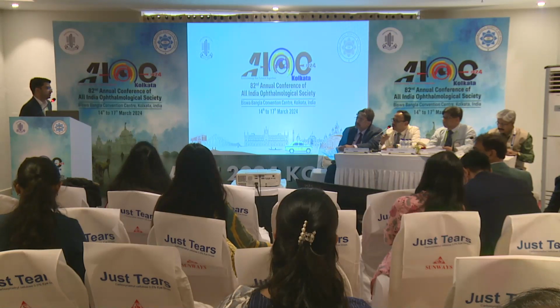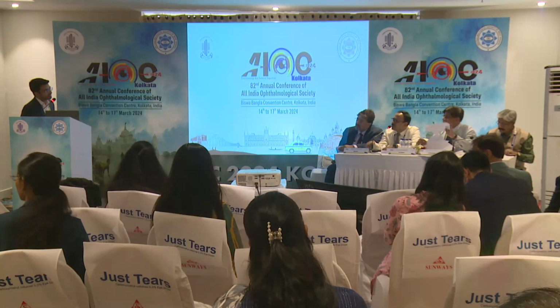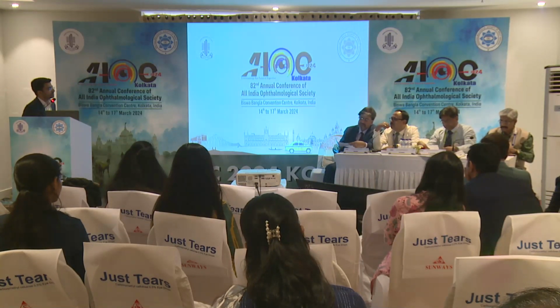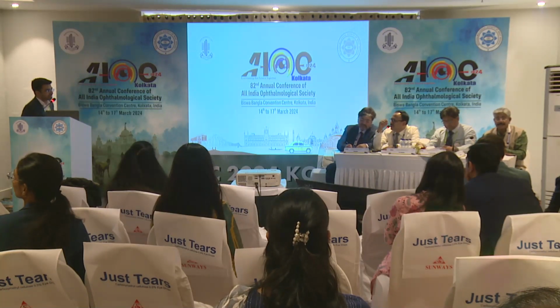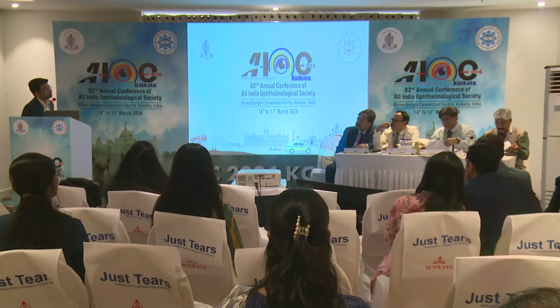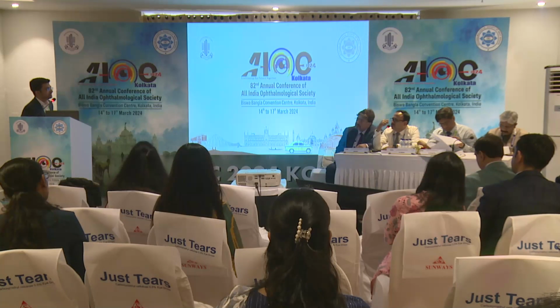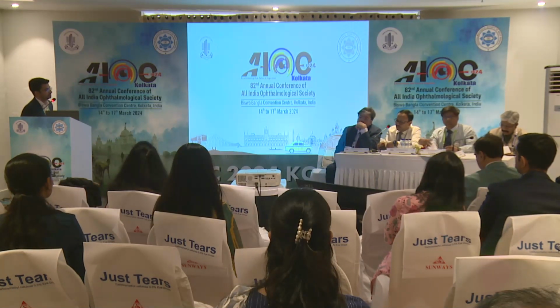Okay. That's why she did a laser. So instead of leaving it, did you give some tamponade to the patient? It was left under fluid only, sir. Okay, so I think ideally you would probably have given some tamponade if you have a retinal lesion. So there was no active treatable lesion, but some suspicious lesion. So even when you do a laser and you did a complete vitrectomy, I think you can leave it under air also. Okay.